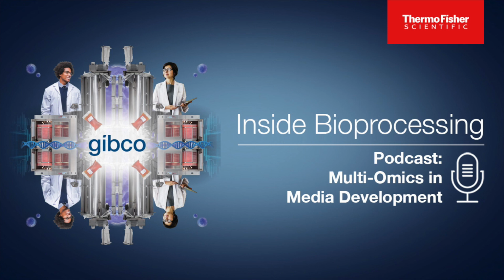And then from that, we try to determine what attributes of that are affecting titer or affecting growth or affecting a product quality attribute, and what are the influencers on those aspects that we really care about in terms of the production of the therapeutic. And from there, we will design some experiments around those pathways to try to get to that final formulation.